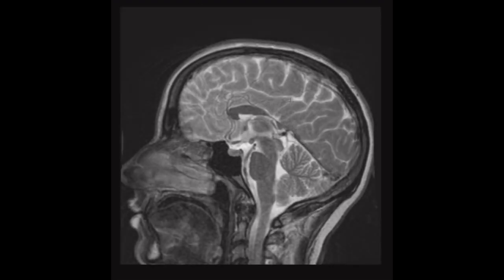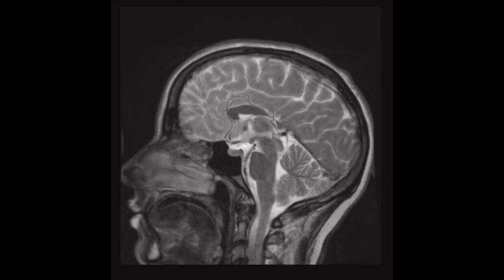We look at the corpus callosum best in the sagittal view, and we see it right here. This is the corpus callosum, and it is abnormal — it's very small. The front, down at the bottom, is called the rostrum — it's small and blunted. This is the genu, where it makes a turn like the knee, and that looks normal in size. This is the body; the front of the body looks pretty good, but the posterior body back here is very small and very thin. And the back part, the splenium, is very small. From front to back, it's too small as well.